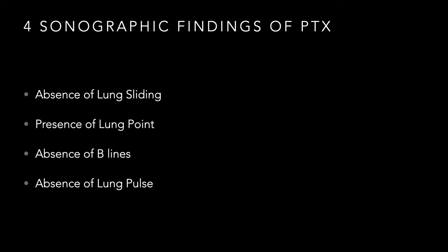According to this document, according to the guidelines, there are four essential sonographic findings in pneumothorax, right? Absence of lung sliding, check. Presence of a lung point, interesting, we'll talk about that in just a sec. Absence of B lines, interesting, we'll talk about that in a minute. And then absence of lung pulse.